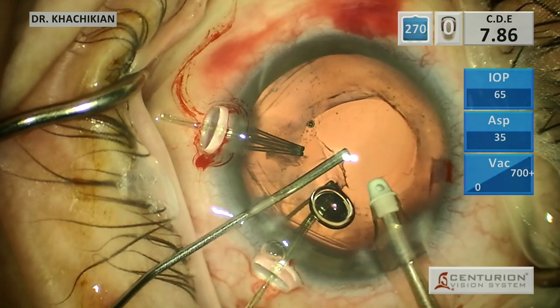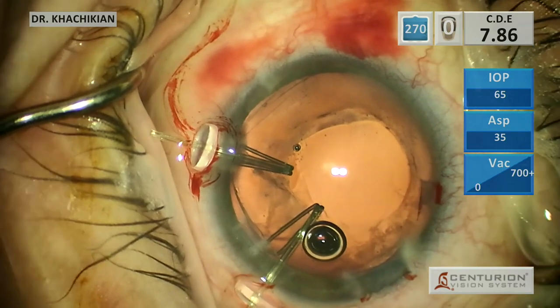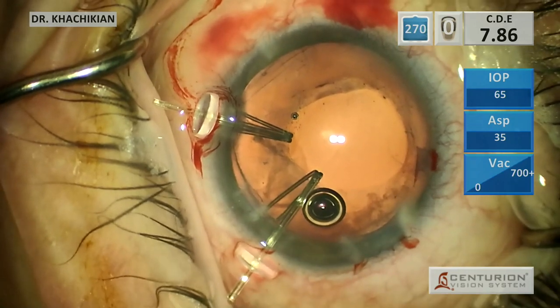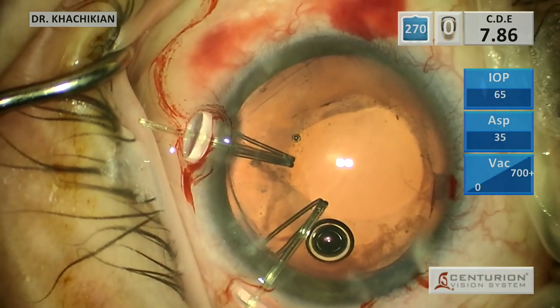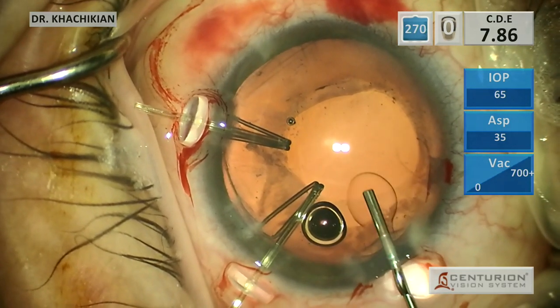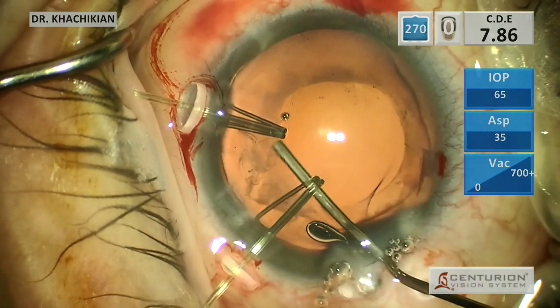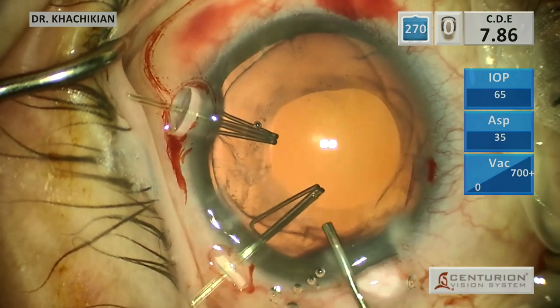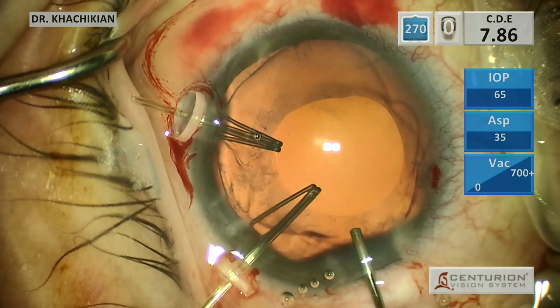Now again, viscoelastic in, IA probe out. So what's next? We've got the whole lens out, the capsule is intact. We've got two capsular hooks superiorly. We're clearly going to have to put in some sort of capsular tension ring, and then probably a capsular tension segment.